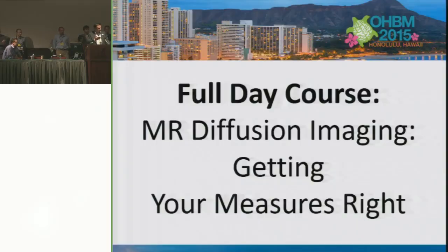I had a similar question this morning. And again, if you've got poor quality gradient volumes, then with the robust estimators, ideally this information will be discarded anyhow. So that was my pragmatic approach to tackle that.